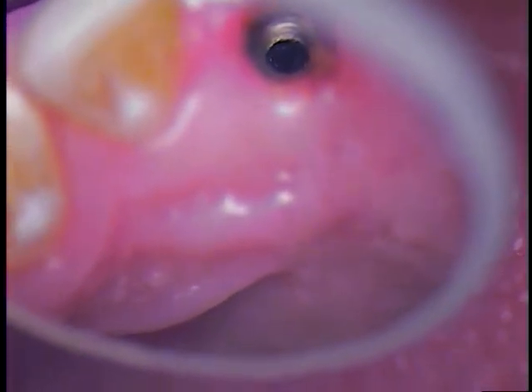Again, this is an old IMZ rescue case. Patient's very young, so we want to keep it going. He'll soon have a crown made, which will join the other crown, central incisor. And we'll get rid of that and take a new one. I'm going to rinse that out. We'll go straight in.